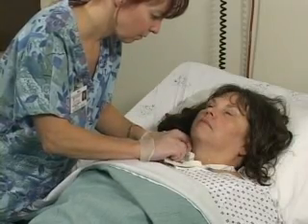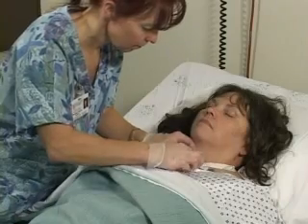Discard all used materials and wash your hands. As with all procedures, document the client's response to the treatment and that the treatment was completed. This procedure becomes more comfortable for the client the longer the tracheostomy tube is in place. As long as the client is made to feel secure and secretions are frequently removed, the tracheostomy cleaning procedure should feel safe for the client.